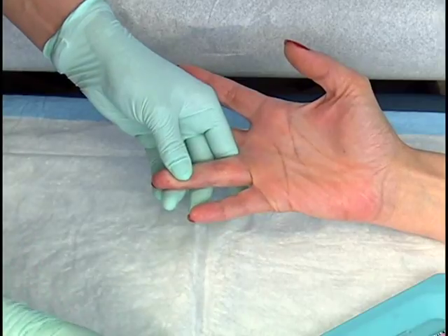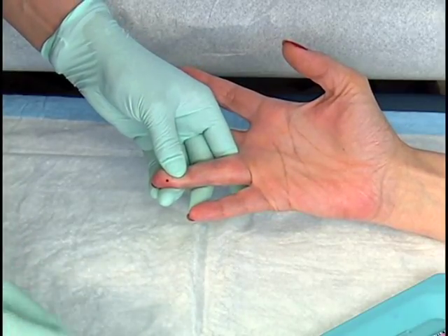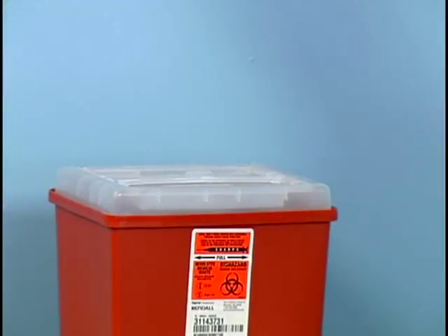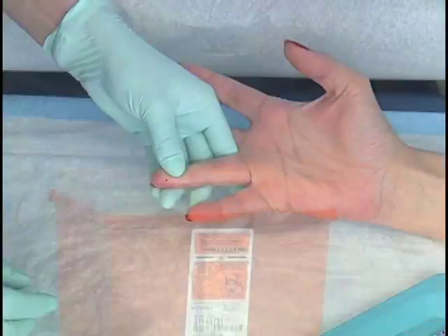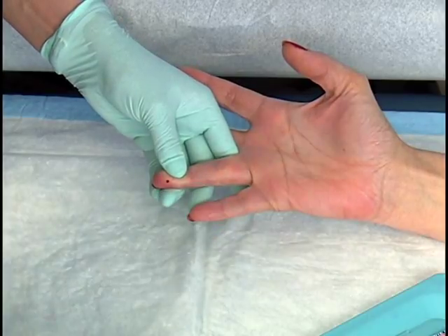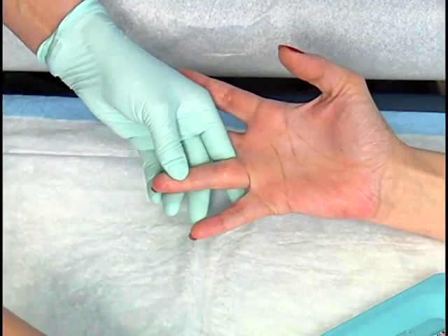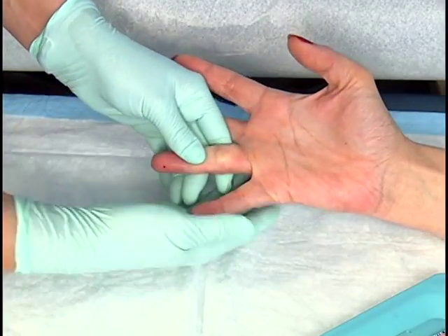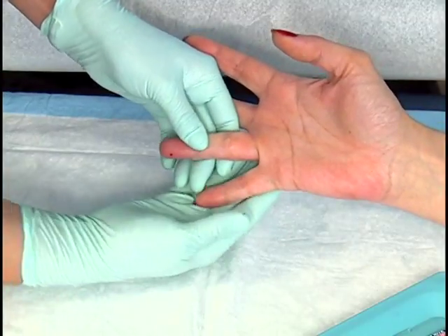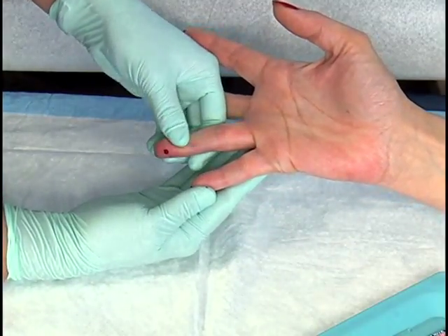A well-made puncture results in a free-flowing wound that requires only slight pressure to make it bleed. Immediately dispose of the Lancet in a biohazard sharps container. Wait a few seconds to allow blood flow to begin. Wipe away the first drop of blood with a gauze pad. The first drop of blood is diluted with alcohol and tissue fluid and is not a suitable specimen. Use the second drop of blood for the test.